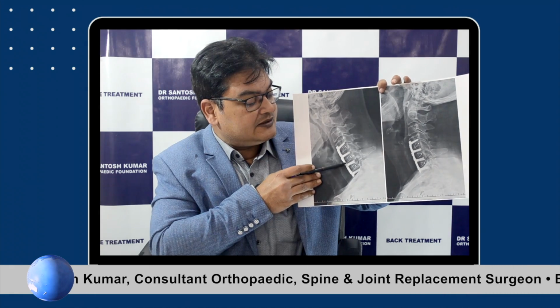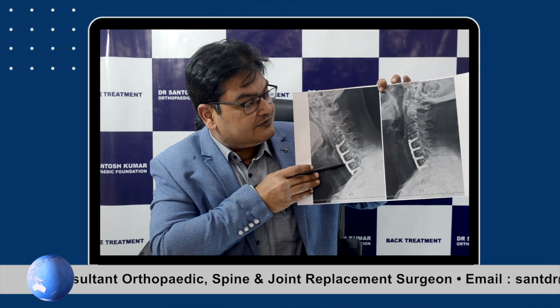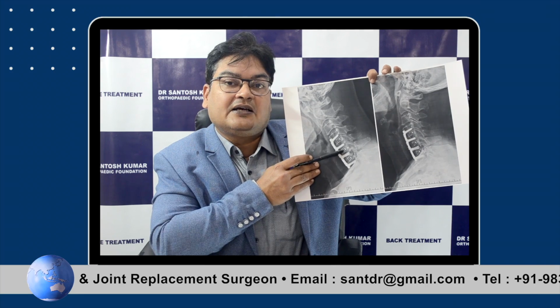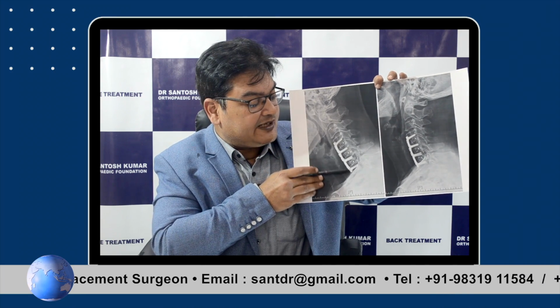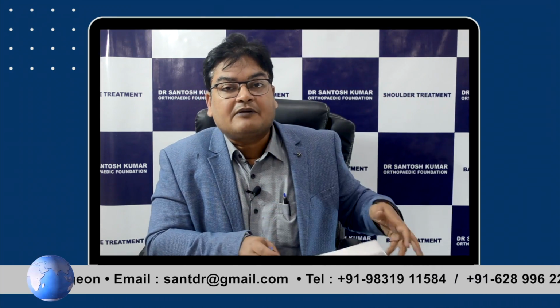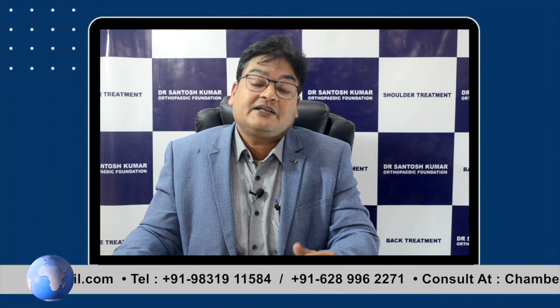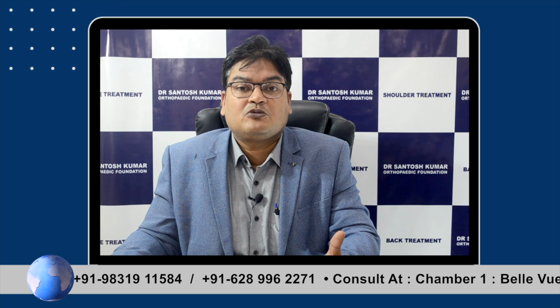Anteriorly in this X-ray we have done a fusion. The fusion is being shown at 3 levels. The disc has been removed, a spacer has been put and a plate has been applied. Now the problem with fusion is that it fuses that segment of the spine, but it doesn't mean that the person will not be able to move his or her neck.